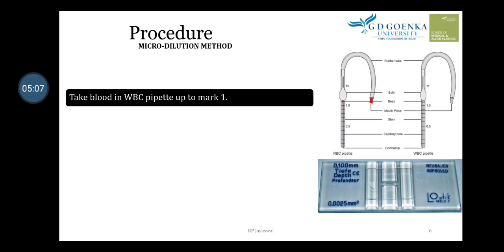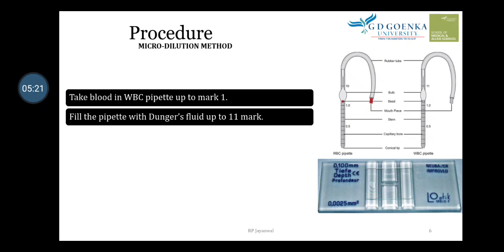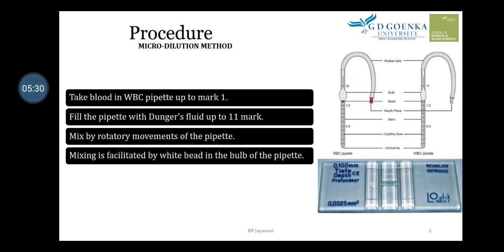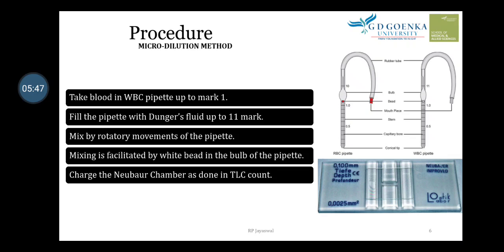Procedure step by step: take blood in the WBC pipette up to the mark 1. Then fill the pipette with Dunger's fluid up to the mark 11. Mix by rotatory movement of the pipette — mixing is facilitated by the white bead in the bulb of the pipette. Then charge the Neubauer chamber as done in TLC count.